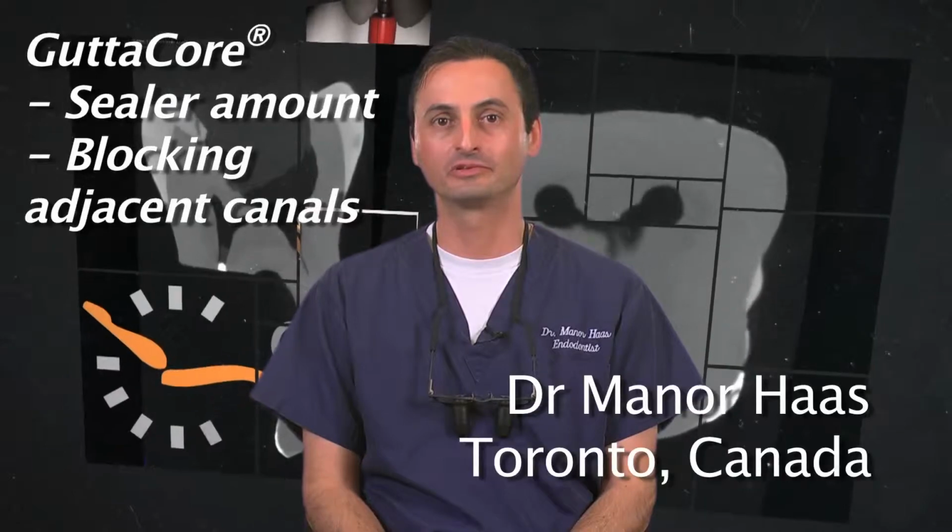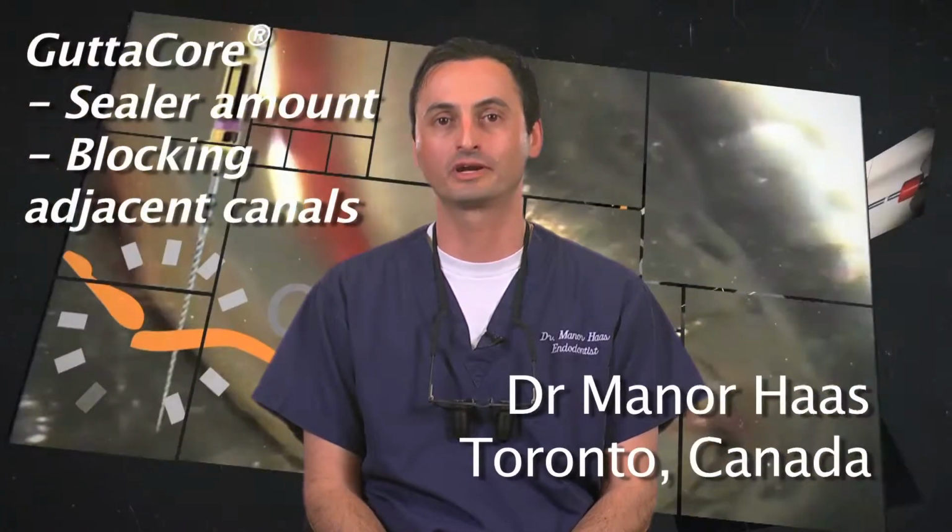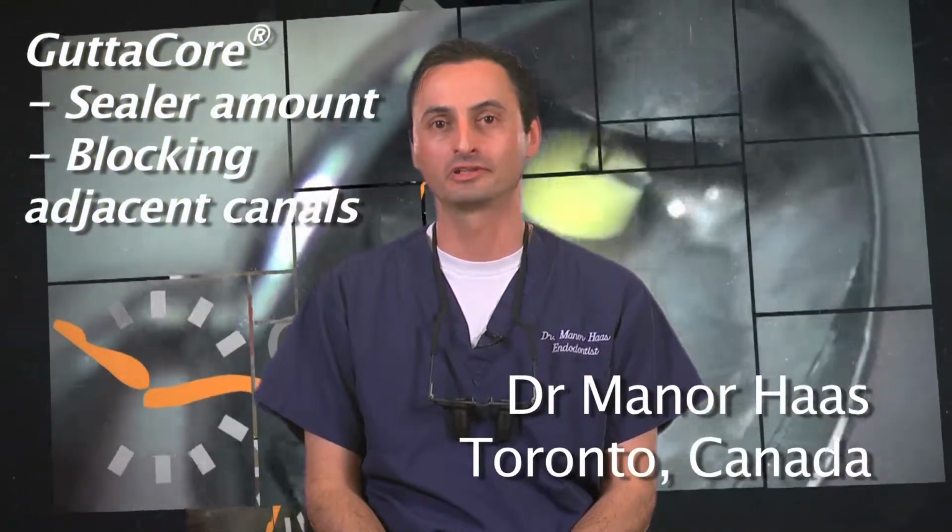In this segment, I would like to review sealer placement in the canals and how to block adjacent canals from excess warm gutta percha that may flow over and block them out.